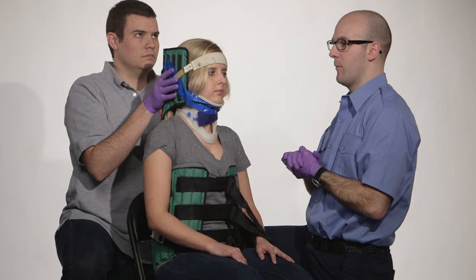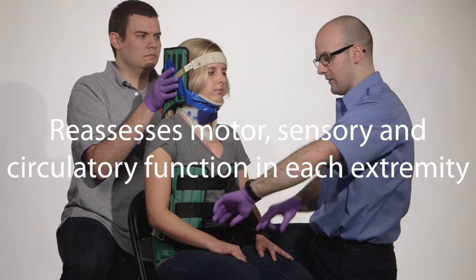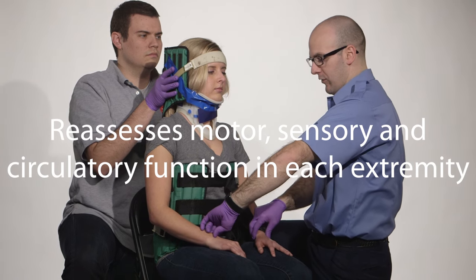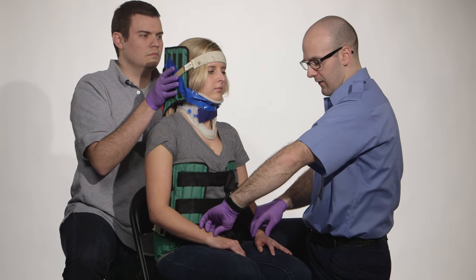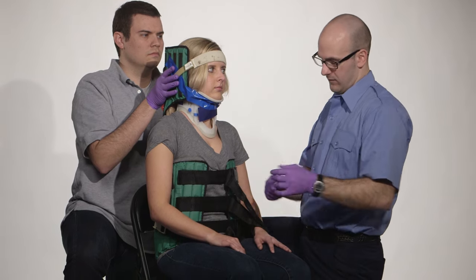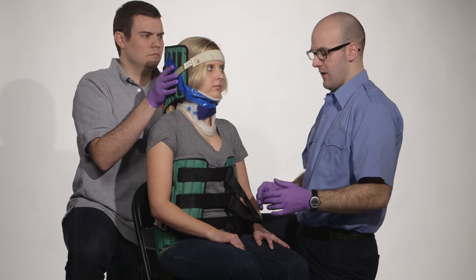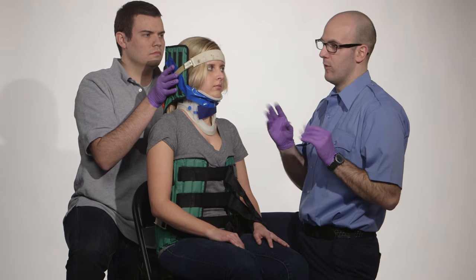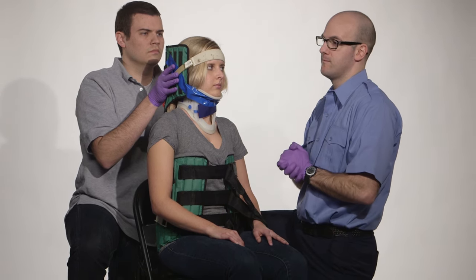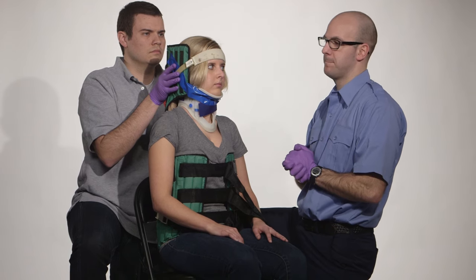Once we had her secured to the long backboard, I would again reassess CMS — feeling for pulses on both the feet and the arms, checking sensation, and then having her move both of them for me. Circulation, sensation, and motor function are all present in my extremities.